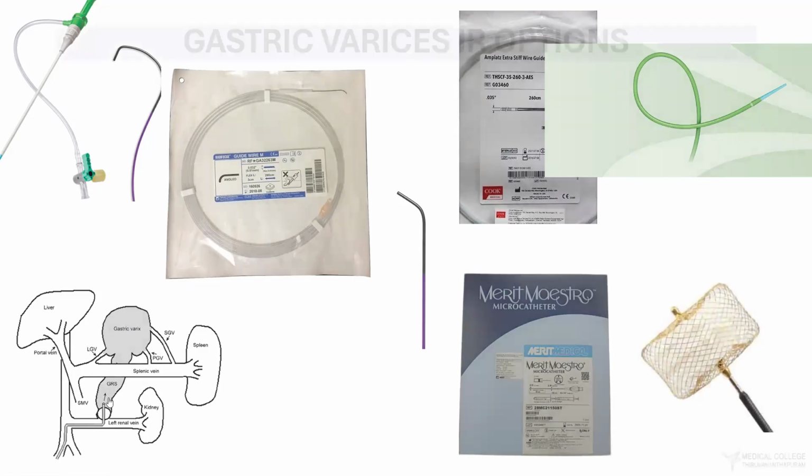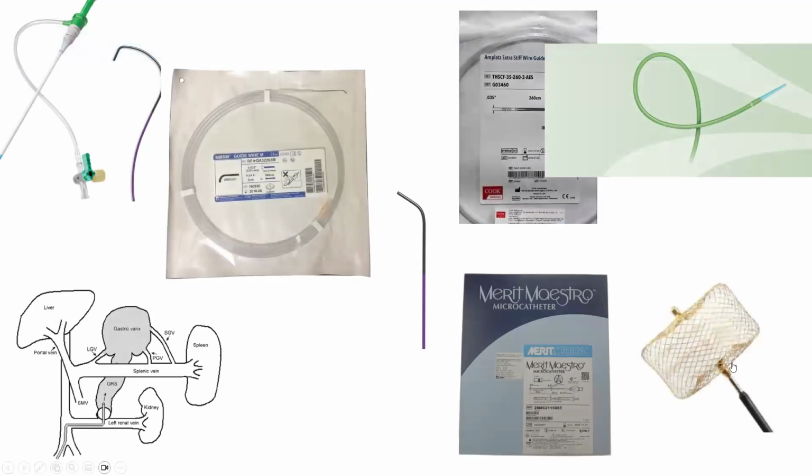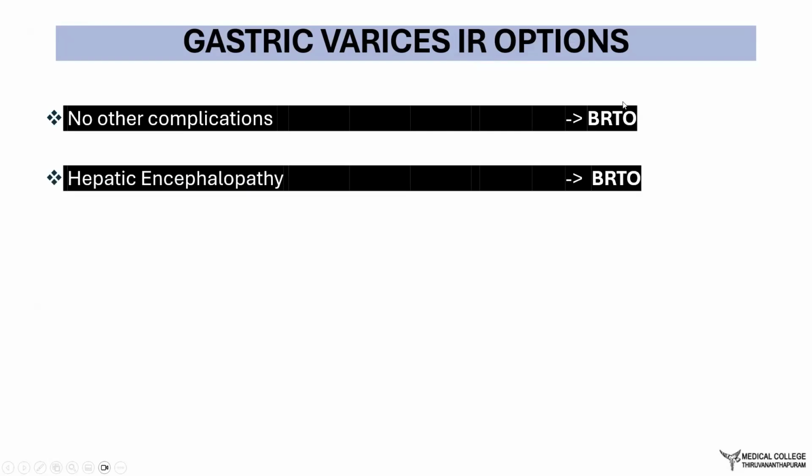The advantage of Cera over Amplatz is generally that the size of the required sheath is relatively less when compared to the Amplatz. This is a relatively light device, so even an 8 French will accommodate up to 20 mm of your Cera vascular plug, which will suffice in most cases. And in general, in our practice, we have not had any specific issues with the Cera vascular plug. So these are things I presume that most people are aware of.